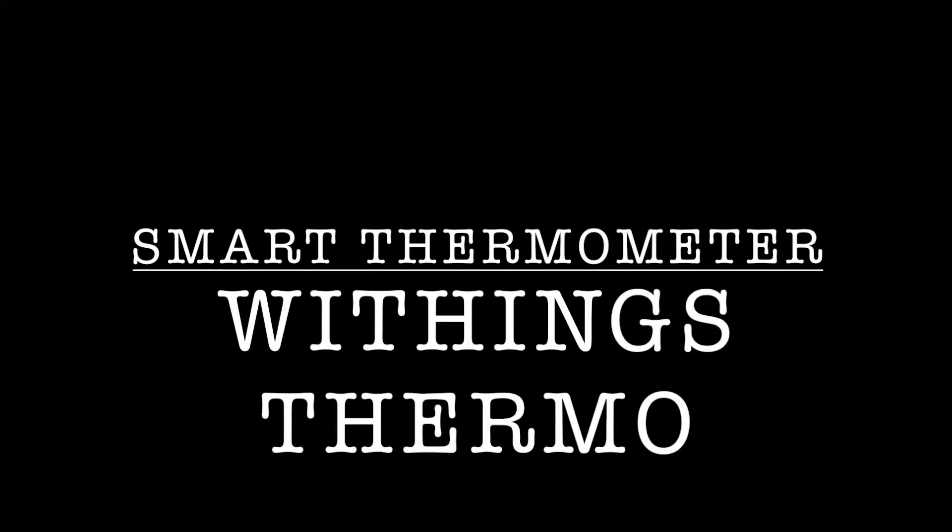Welcome back to The Tech Couch. Today I've got the Withings Thermo, which is a smart temporal thermometer, and I'm going to be showing you this product. I'm going to do the unboxing and a quick demo of it and show you how it works.